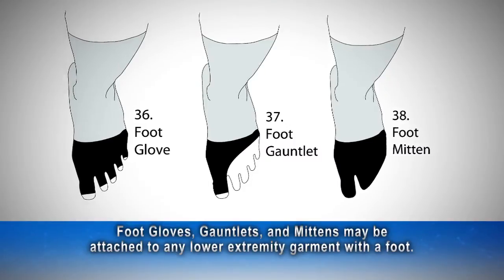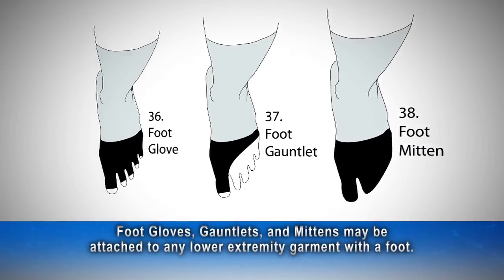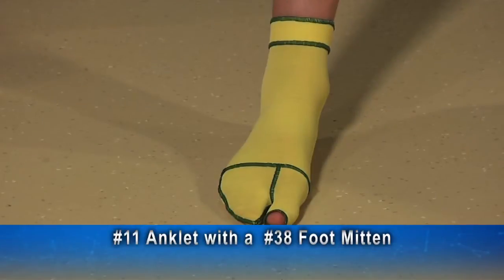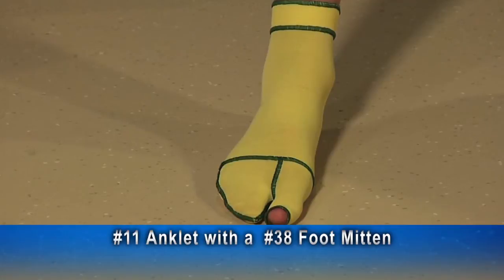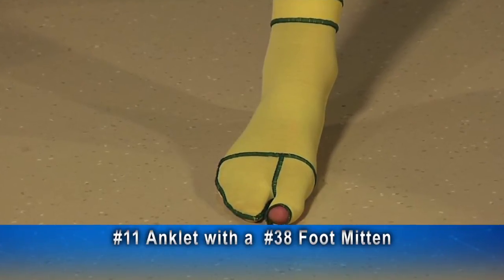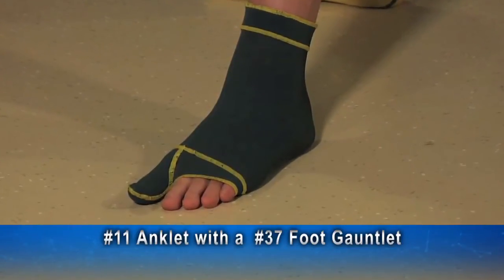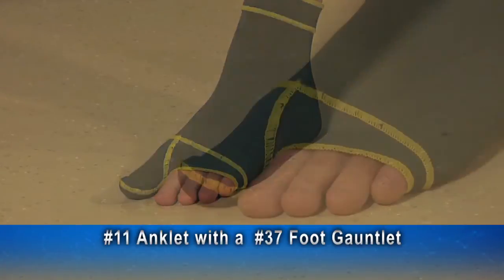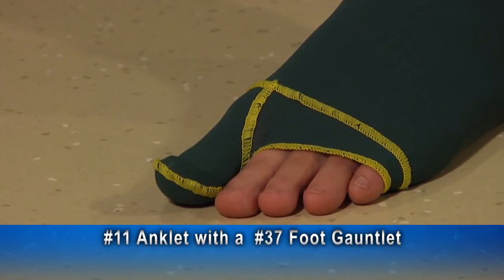Foot gloves, gauntlets, and mittens may be attached to any lower extremity garment with a foot. Here is a number 11 anklet attached to a number 38 foot mitten. On the example shown here, the great toe piece is open and the other toes share a common covering. This number 11 anklet has an attached number 37 foot gauntlet, where the great toe is enclosed and the other toes share a common opening.